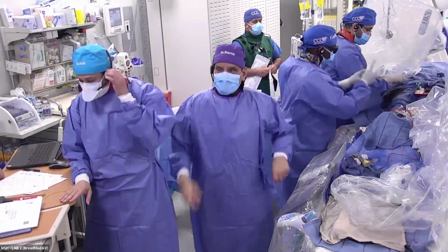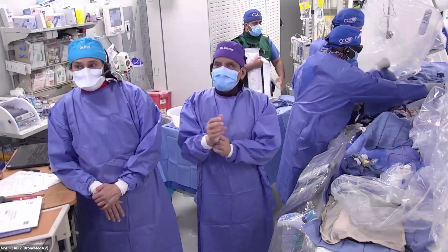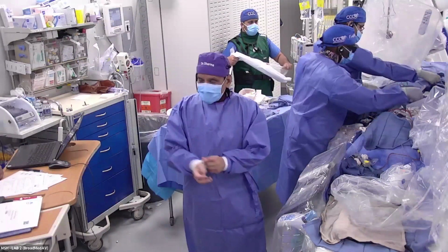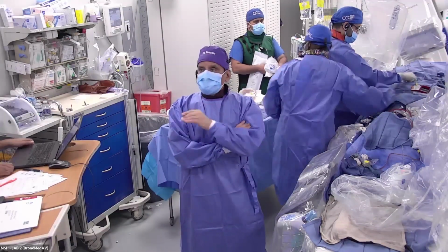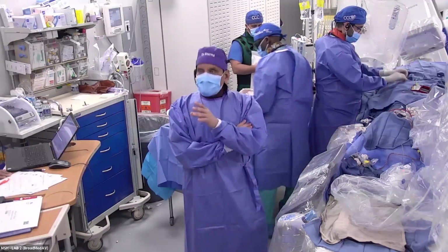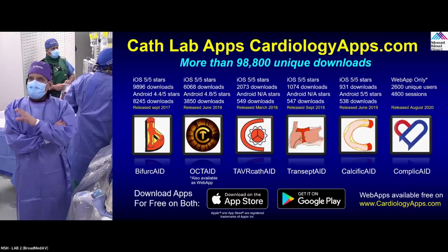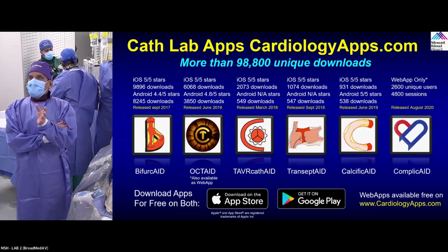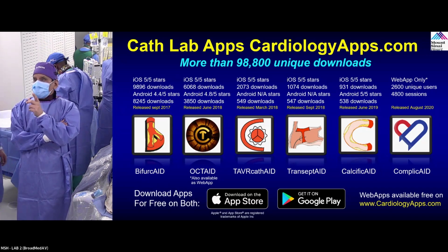So therefore, if there is little slow flow, you see a little dissection at the ostium, you see some EKG changes, patient having chest pain, then I would just decide there. Not just by looking at a hazy lesion like this case and decide based on the FFR. We stopped doing it because there is no trial to support that. Most of them have shown that the FFR will be negative in the majority of those cases, even if your side branch stenosis is 90+%.